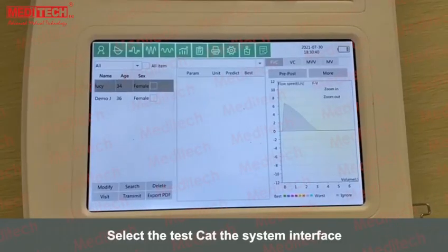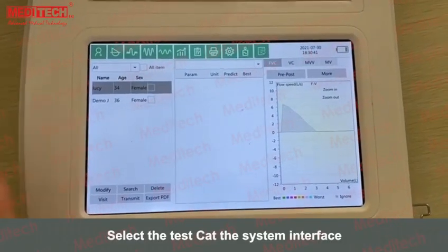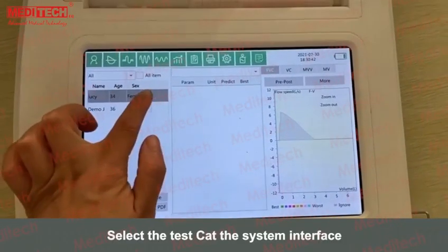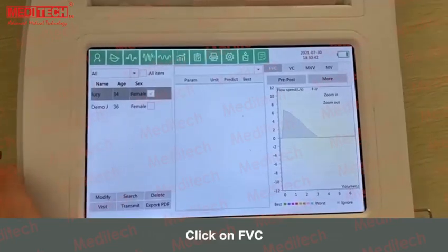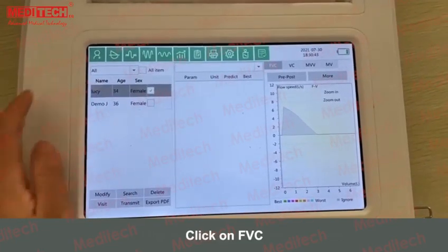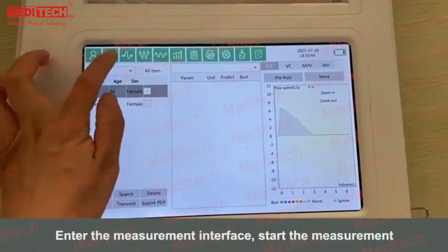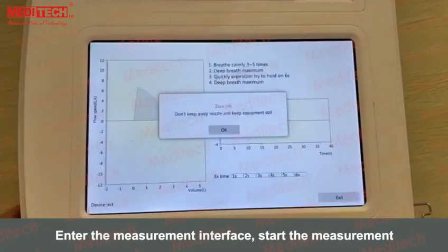Select the test specimen at the system interface. Click on FVC. Enter the measurement interface and start the measurement.